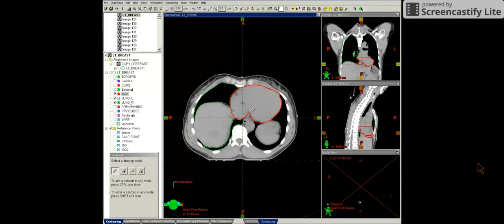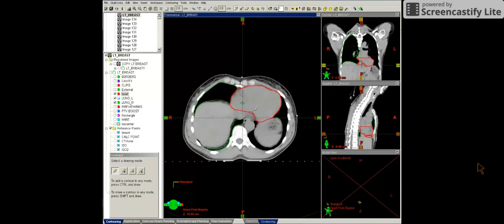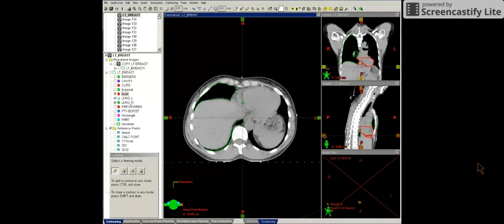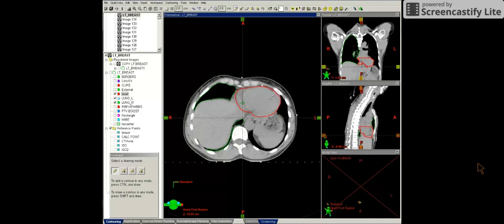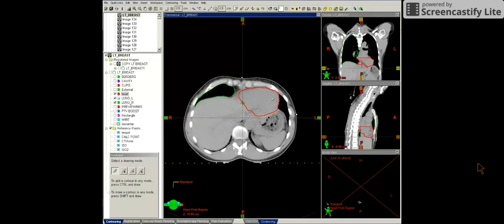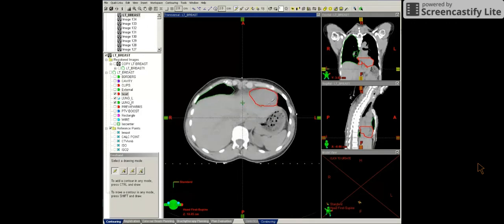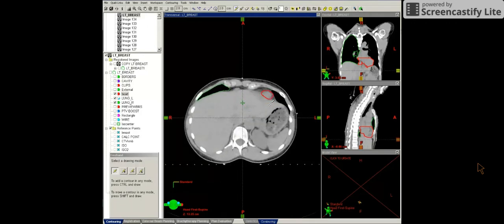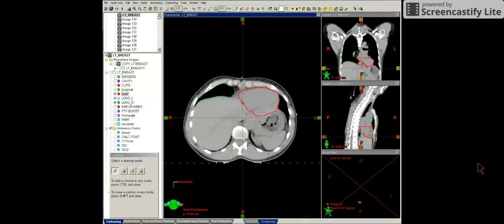And let's continue inferiorly. Let's do one more slice of the heart here. And we'll follow the heart until it ends. This is the last slice of the heart.